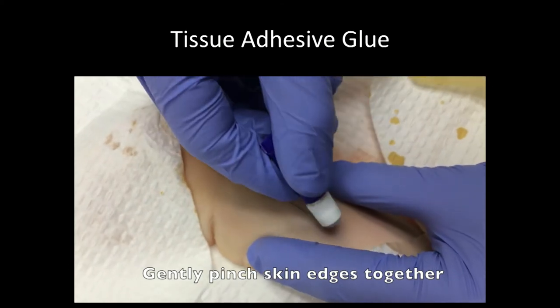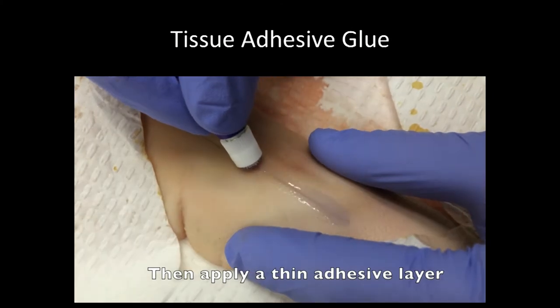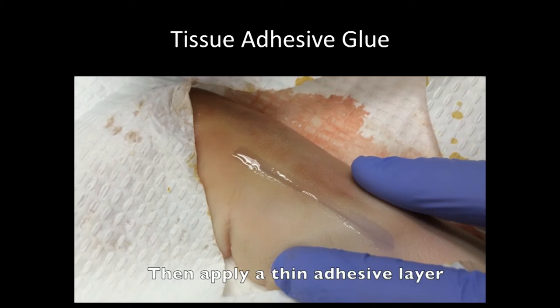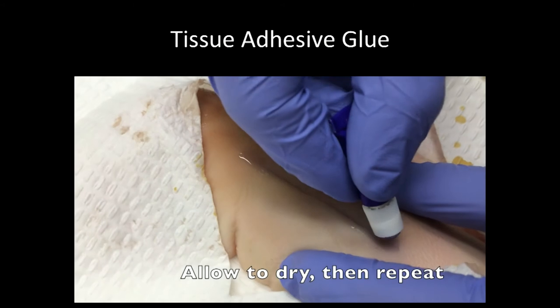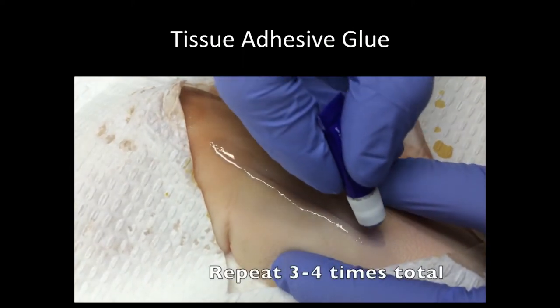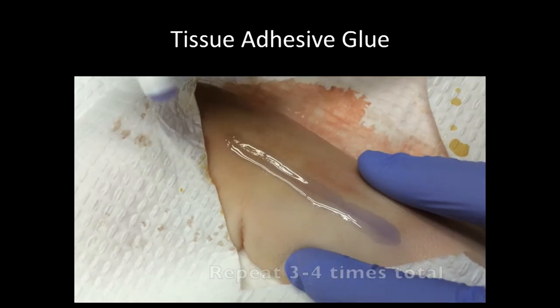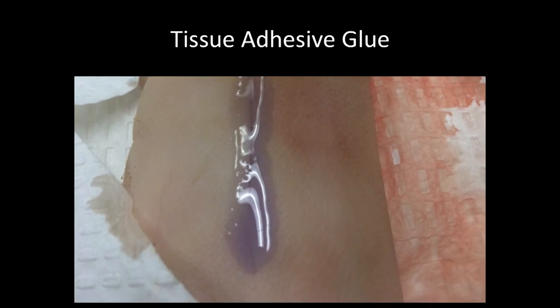What you're going to do is gently pinch those skin edges together as you apply a thin layer of that adhesive glue across the wound, almost like you're painting the wound. You're going to give that a couple minutes to dry, continuing to hold pressure on the wound with your hand, and you're going to repeat the process, applying a second layer of the glue. Ultimately, you're going to apply about 3 to 4 total layers of tissue adhesive glue, and make sure that you hold those edges of the wound together for at least a minute. But that gives you a nice closure of the wound without the use of sutures, staples, without a need for a return visit.